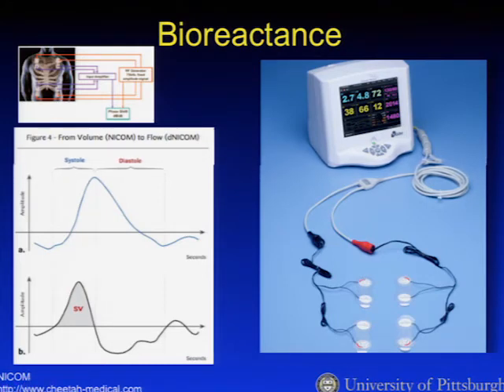The NICOM signal is correlated mainly with aortic blood volume, and since flow is the change in volume by time, the stroke volume actually correlates with the derivative of the NICOM signal in time, indicated down here.